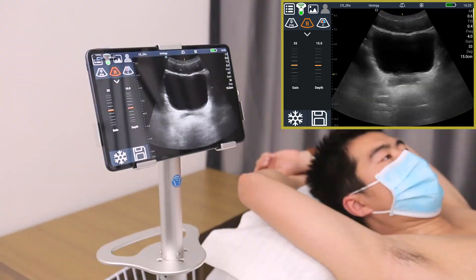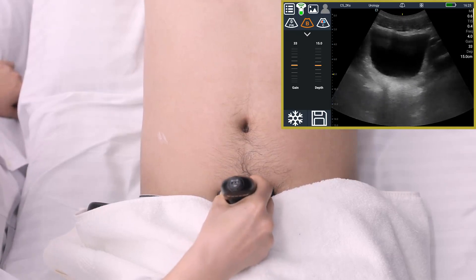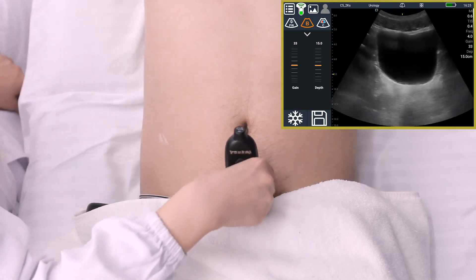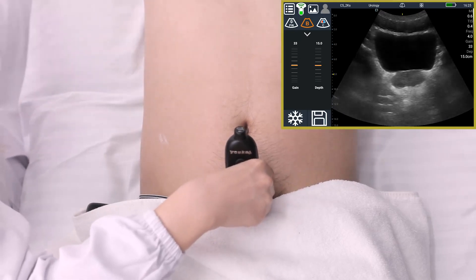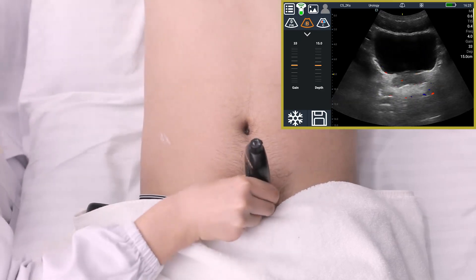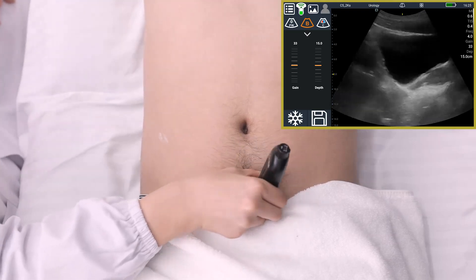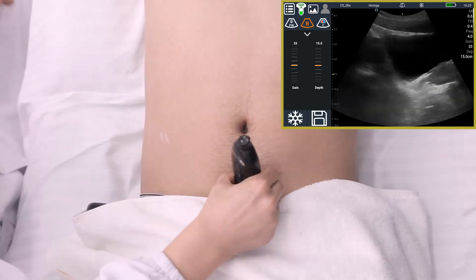Scan the bladder to observe the side wall and filling of the bladder, and whether the bladder triangle area is occupied. Therefore, this ultra-portable scanner is very suitable for primary general practitioners and family doctors to screen and determine the initial focus of disease, especially suitable for outpatient use. Yaoki Q7 — the doctor's visual stethoscope.